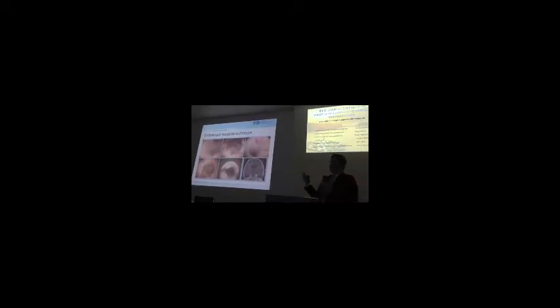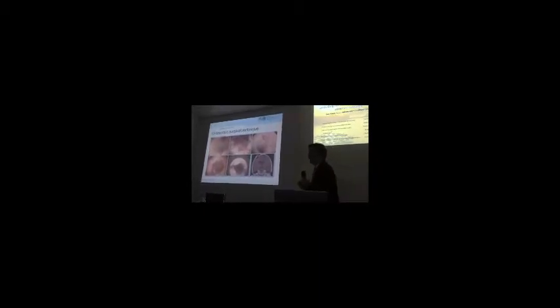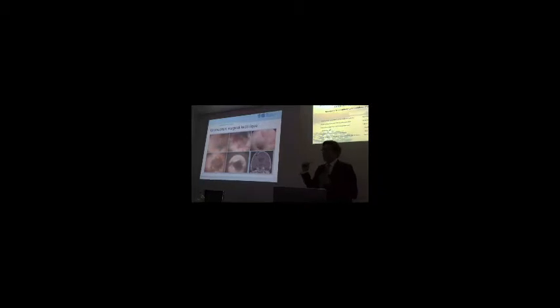ETV in this takes another maybe 3, 4, 5 minutes, and you make sure that you have a nice CSF flow. And because this blood clot removal here is very challenging, I think the risk of trying to get this blood clot out at the aqueduct is much higher than the risk of doing an ETV.